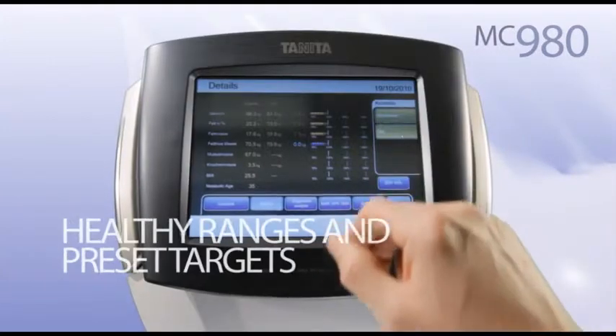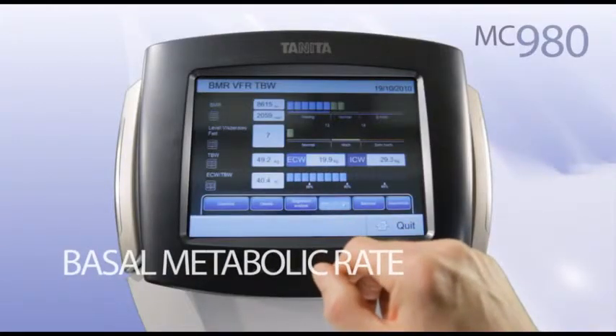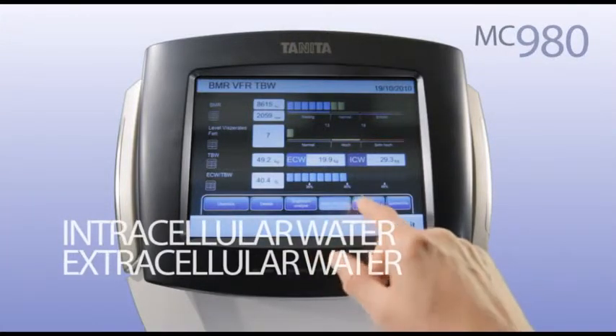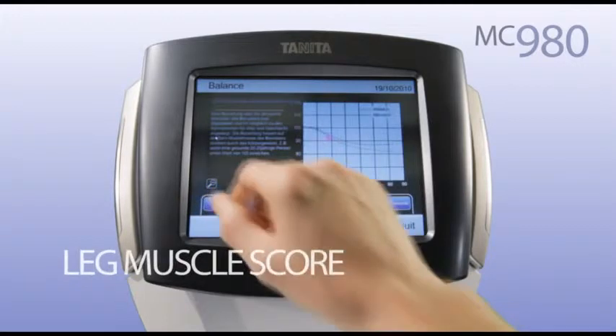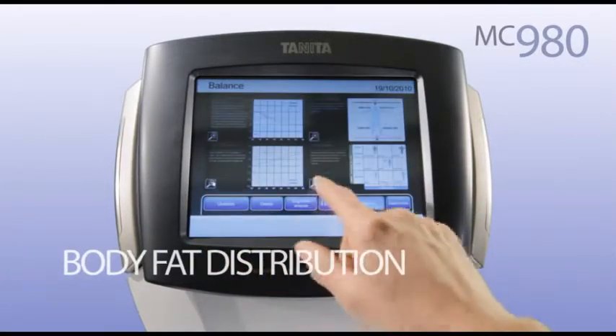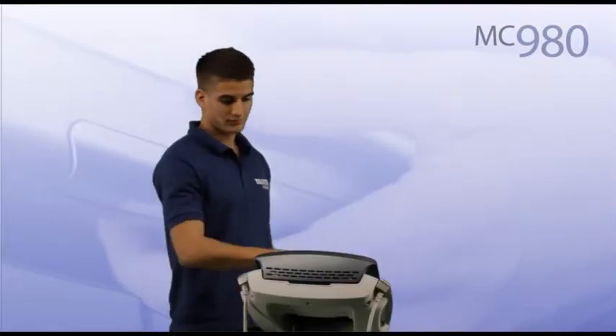With a comparison to healthy ranges and preset targets. Basal metabolic rate, visceral fat level and total body water, intracellular water, extracellular water. Leg muscle score, body balance, body fat distribution, physique rating, impedance readings and phase angle.